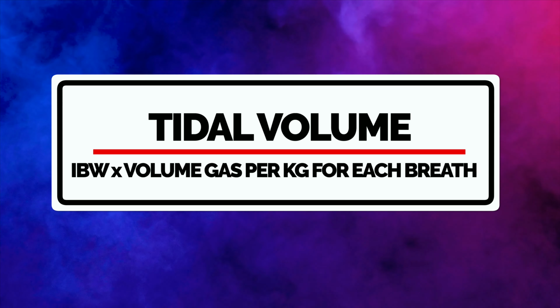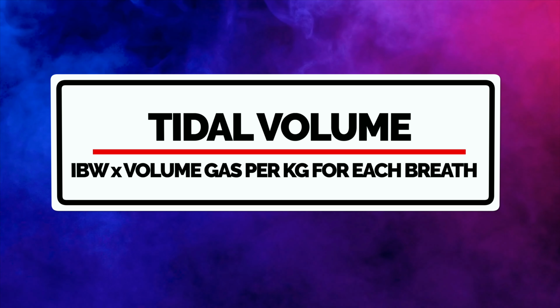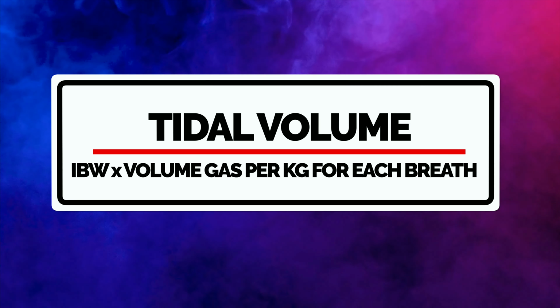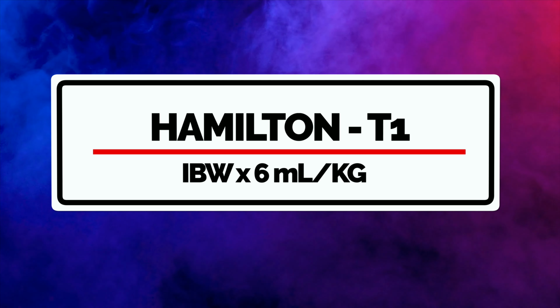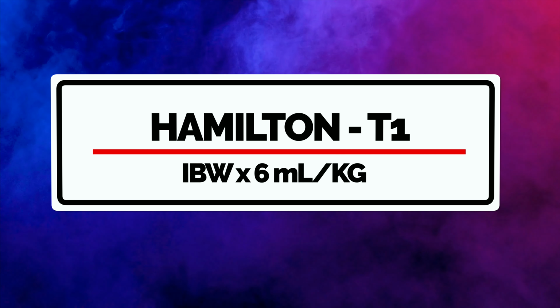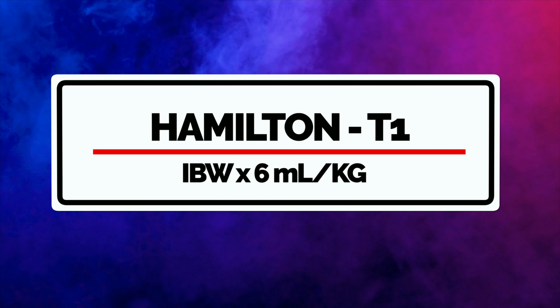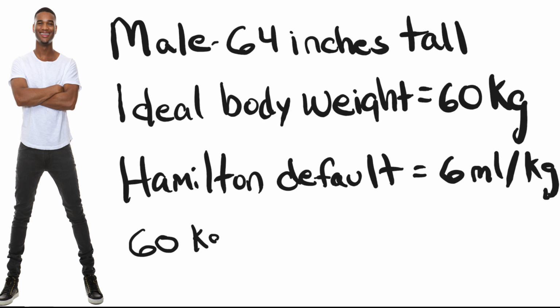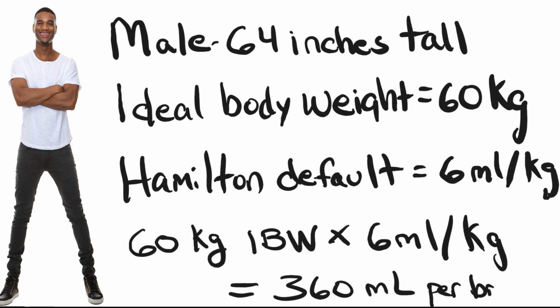Tidal volume equals ideal body weight times the volume of gas per kilogram for each breath. The Hamilton automatically calculates the tidal volume by multiplying the ideal body weight by the default median volume of 6 milliliters per kilogram. If a male patient's ideal body weight is 60 kilograms, the ventilator will initiate ventilation with a tidal volume of 360 milliliters.